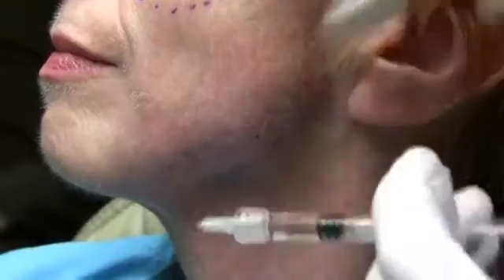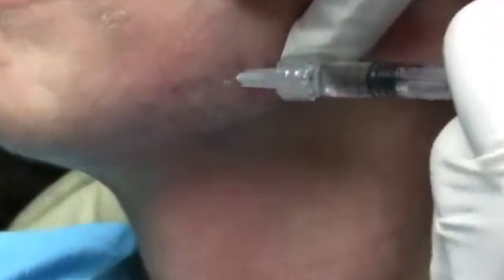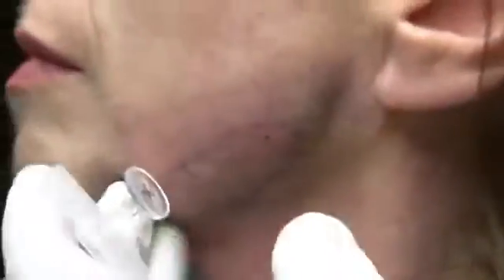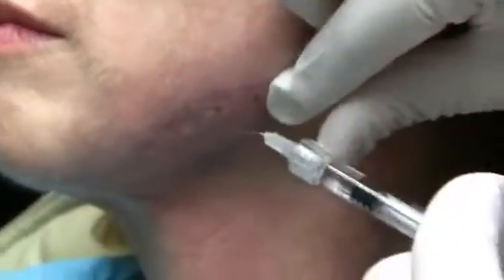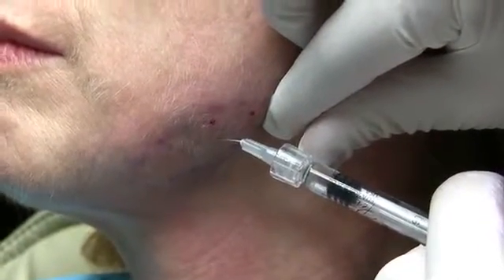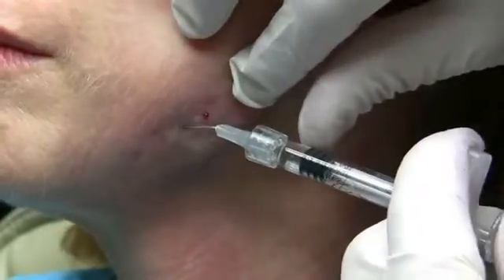And this is Perlane, which is a large particle filler, so it should provide a nice consistency as well as longevity for this area. Now remember, most patients do have a mandibular notch, so I don't need to obliterate this entire region.